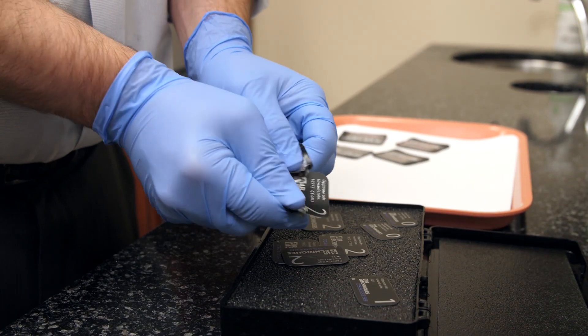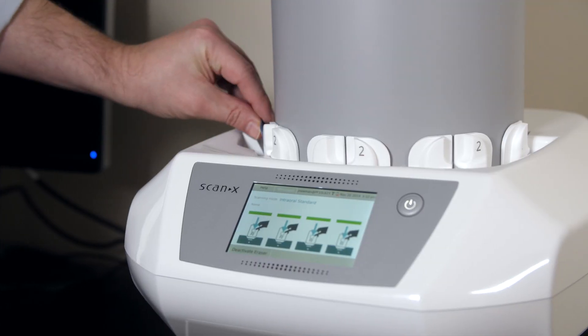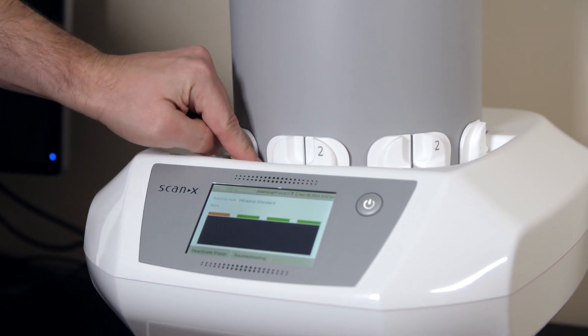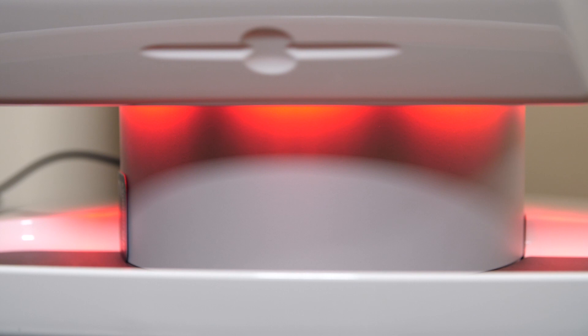In the age of technology, where there's an expectation for immediate results, the ScanX delivers just that. The images are developed rapidly, which allows more time in the chair with the patient, and that can best educate them on their needs.